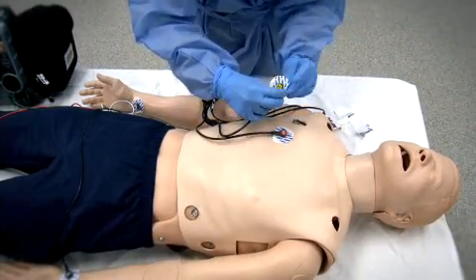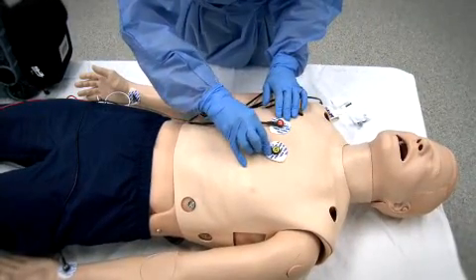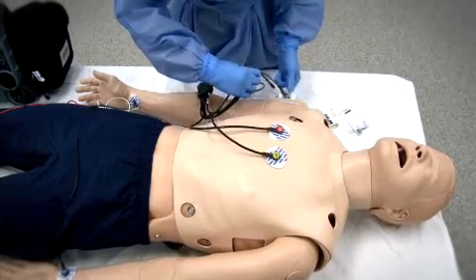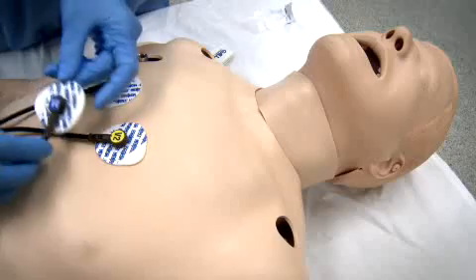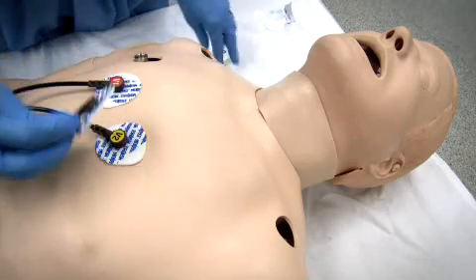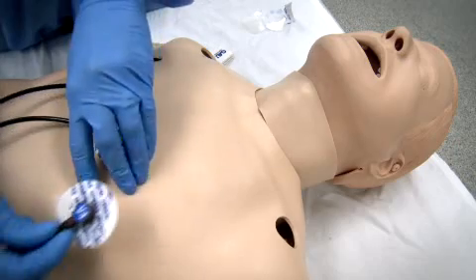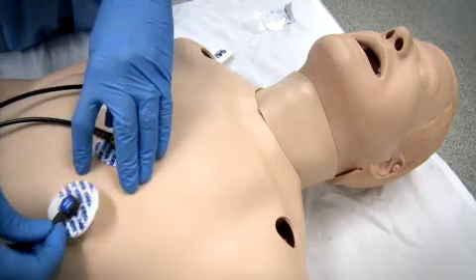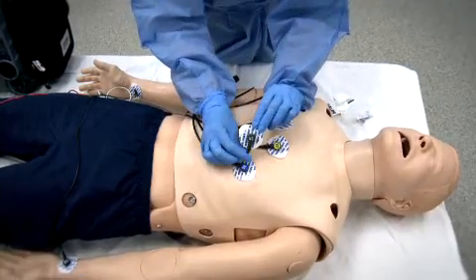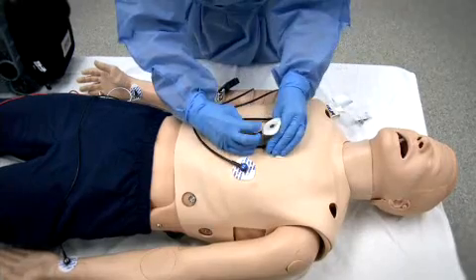Follow this by the V2 lead at the same level, 4th intercostal space, immediately to the left of the sternum. The V4 lead is typically placed next, at the 5th intercostal space, on the midclavicular line on the left side. V3 is placed equidistant between V2 and V4.